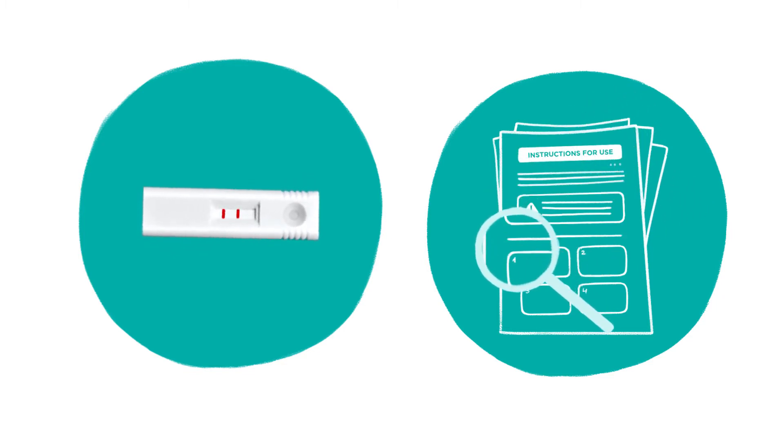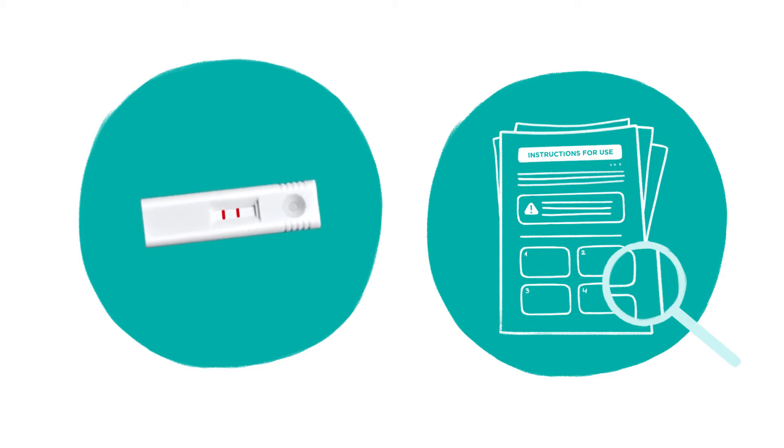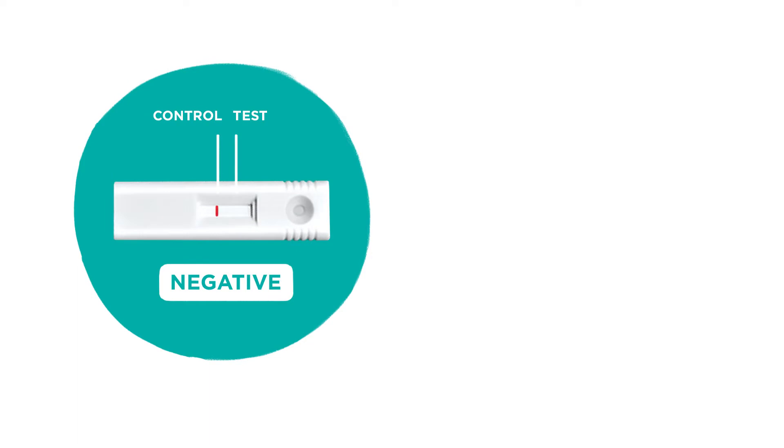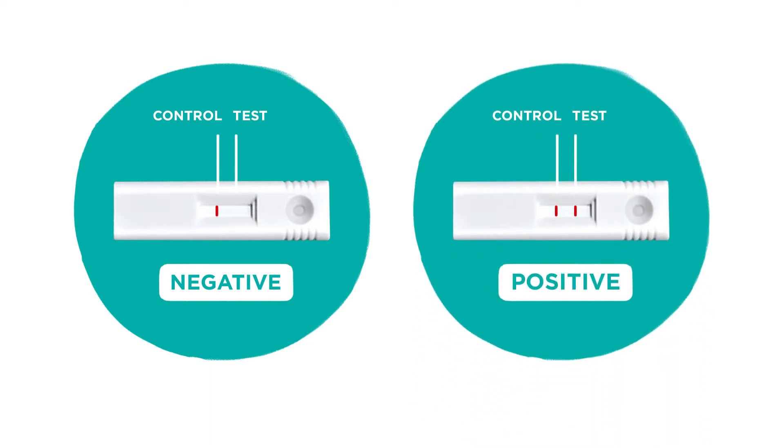This video will walk you through each step and provide a visual cue on how to perform the iStatus COVID-19 Antigen Test. The test cartridge will determine your result. The control line and or the test line will appear at the end of the test.